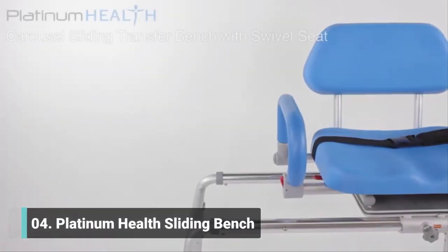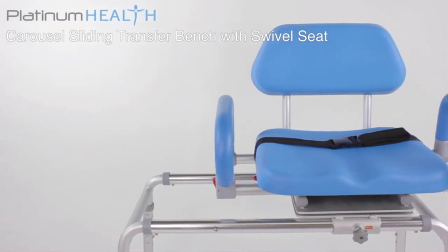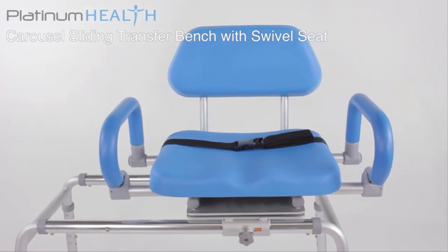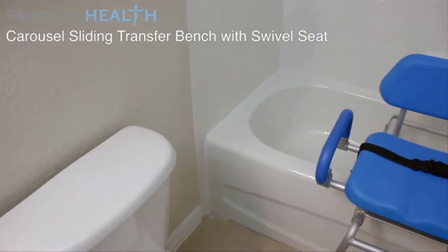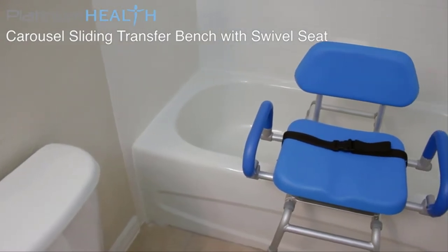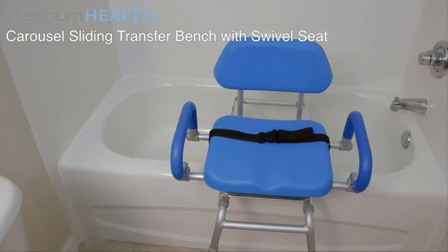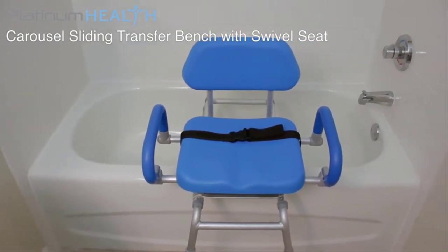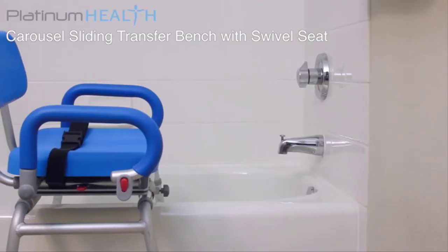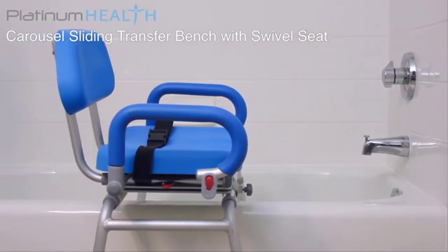Platinum Health invites you to enjoy bathing again with the Carousel Padded Sliding Transfer Bench with Swivel Seat. For individuals with mobility and/or cognitive challenges, safely accessing the tub or shower can be a daunting and often dangerous process. The Carousel was designed by a team of dedicated healthcare professionals to help bring comfort, safety, dignity and pleasure back to bathing.